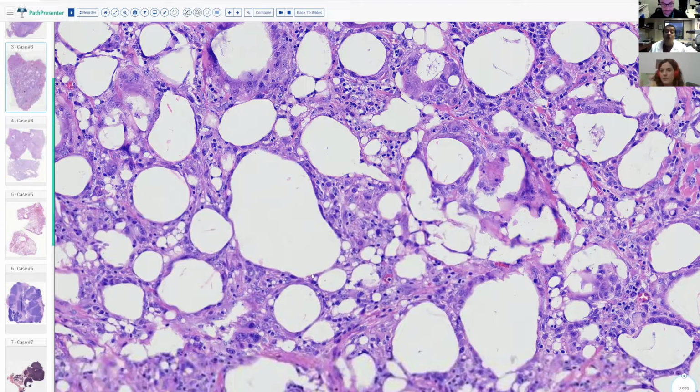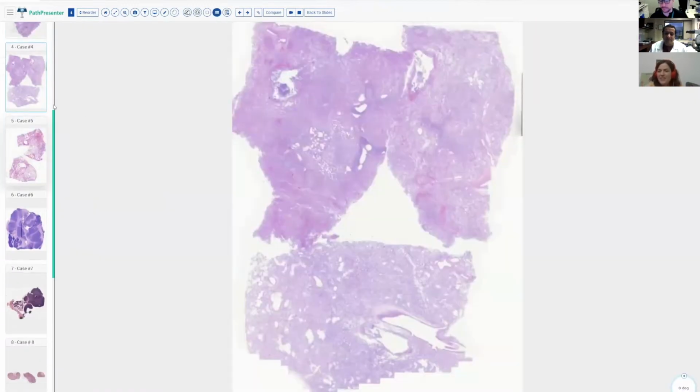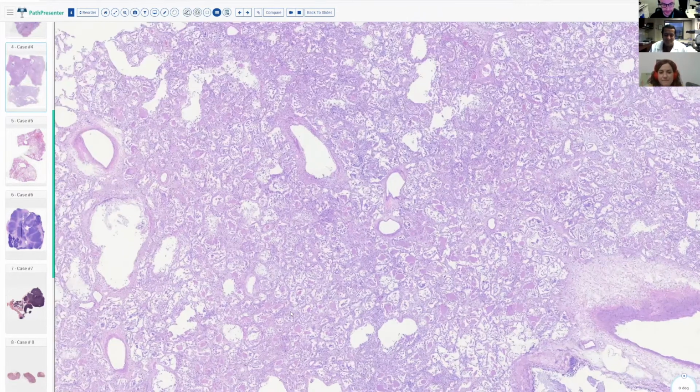Oh, cool. Oh, wow, yes. Scattered food. Then that lady was aspirating. And she had also a problem, I think she couldn't move well or something. She was lying down a lot of the time or something like that. But I said it, and the radiologist was staring at me like saying, it's impossible, that must be a mass. Yeah. Cool. Okay, so let's move on to another case here.